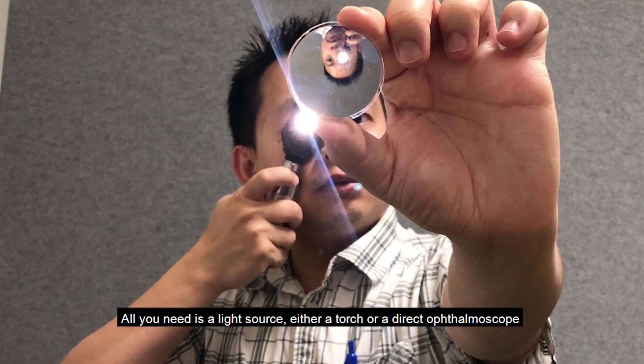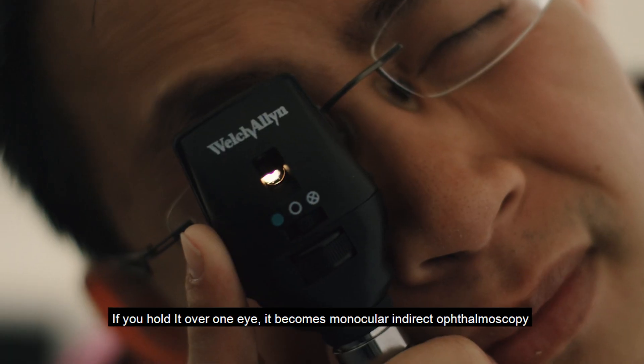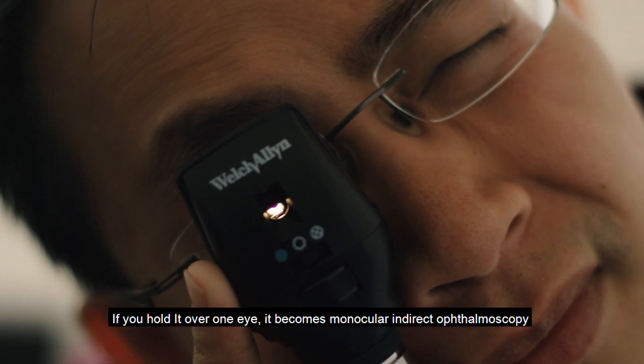All you need is a light source — either a torch or a direct ophthalmoscope. Hold it in between your eyes. If you hold it over one eye, it becomes monocular indirect ophthalmoscopy.